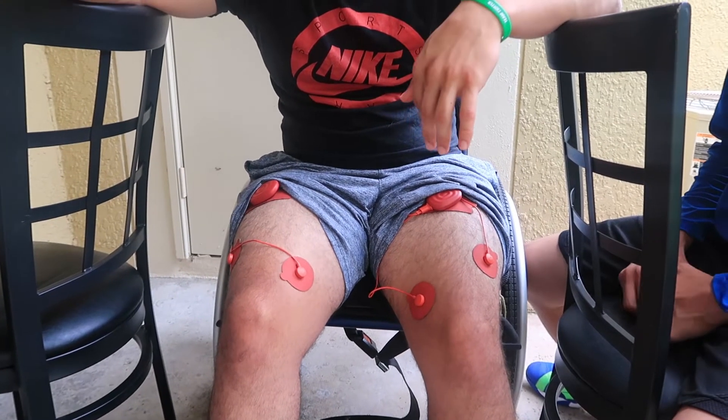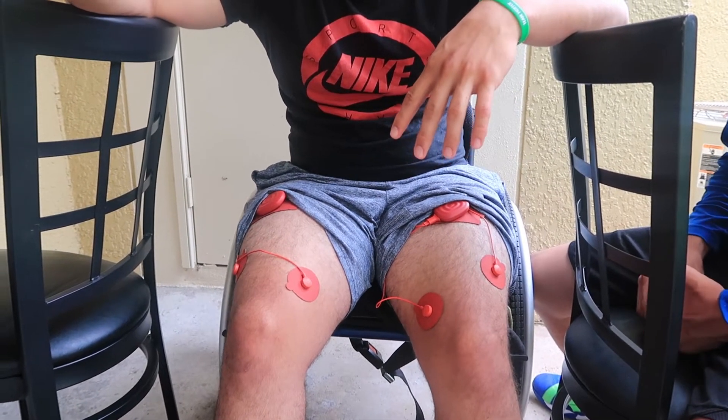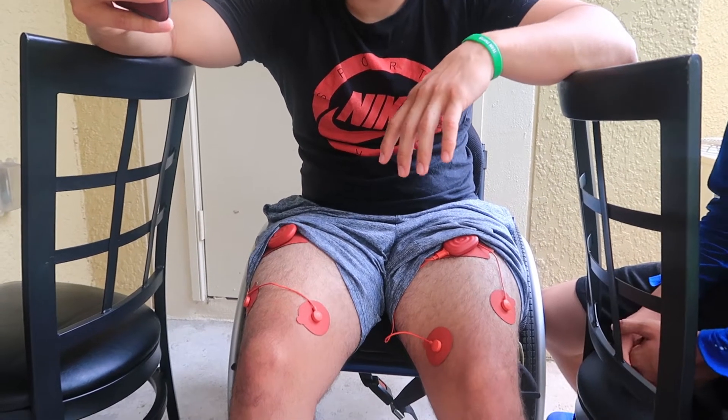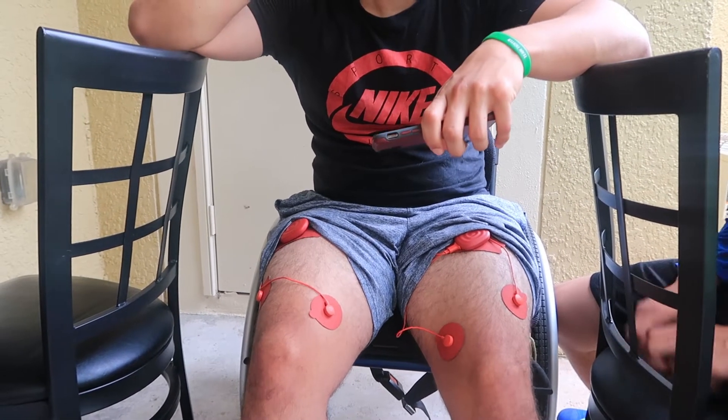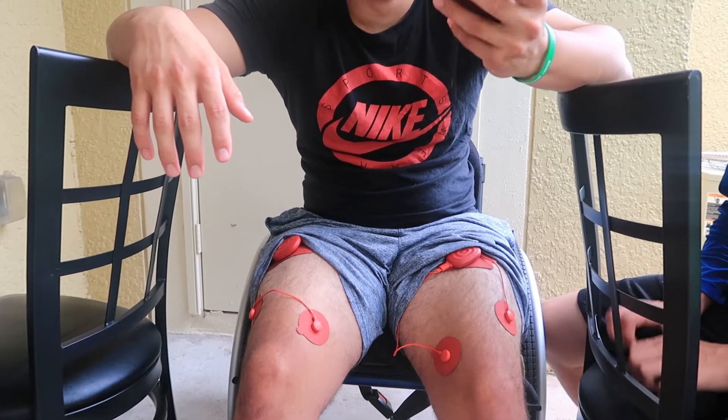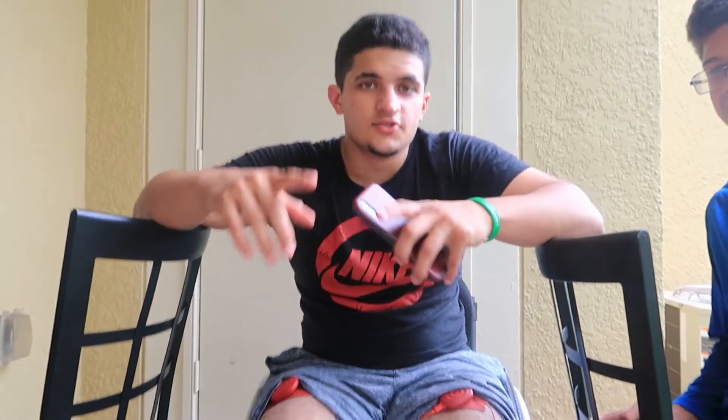I could probably put it up to 20, though I'd probably be in pain at that level. What's the difference between your legs — like the feeling? I won't have a reaction like Roman no matter how far I put this up. I haven't tried to go too hot because I don't want to hurt myself. Because I can't feel it, I won't get a reaction.